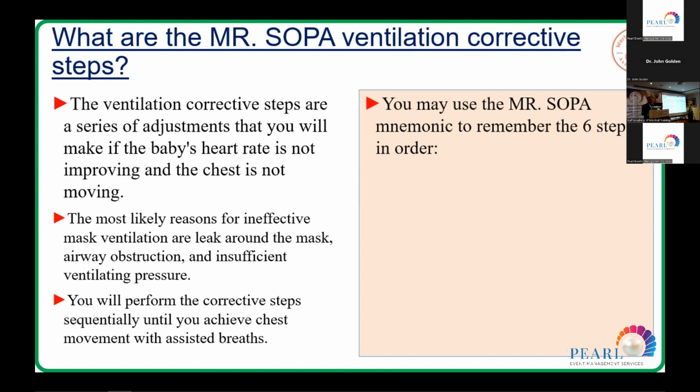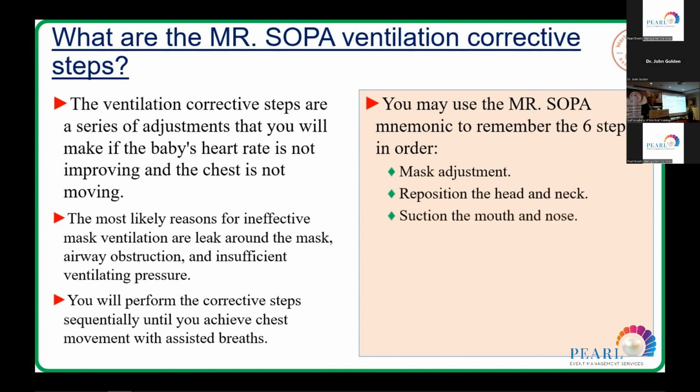You may use the MR. SOPA mnemonic. Remember six steps in order: Mask adjustment, Reposition the head and neck, Suction of the mouth and nose, Open the mouth, Pressure increase, Alternative airway.